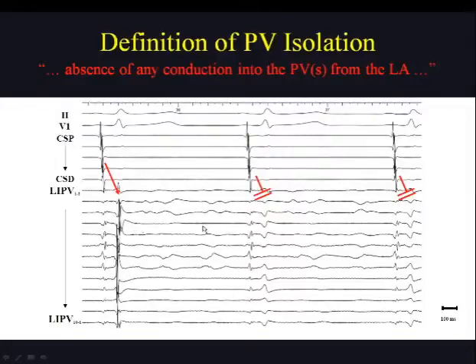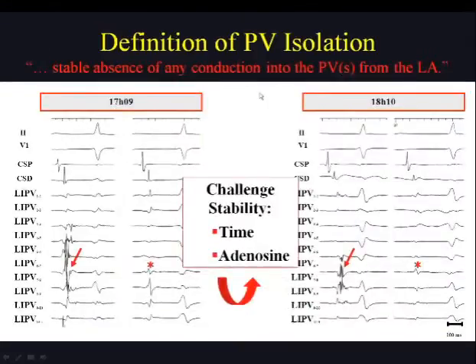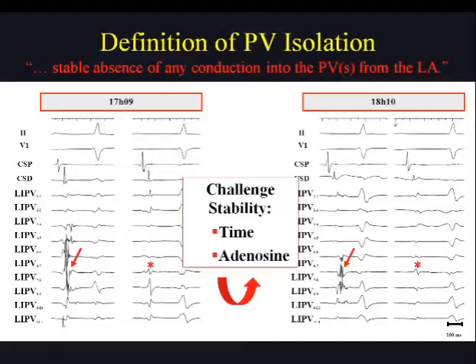Here you see a circular mapping catheter in the left inferior pulmonary vein with complete elimination of the pulmonary vein potentials. The absence of conduction into the PV has to be stable, meaning that your endpoints should be challenged either by time or by adenosine injection.